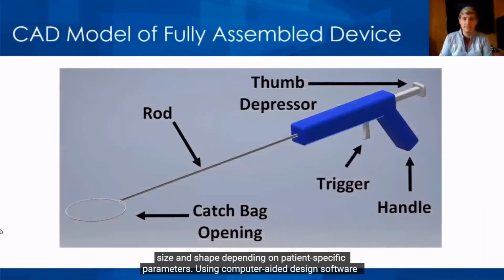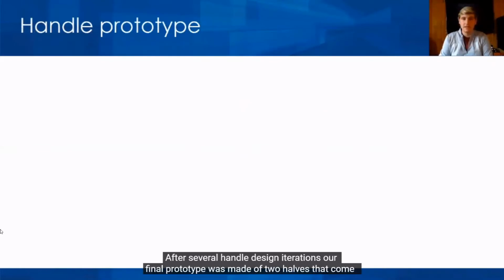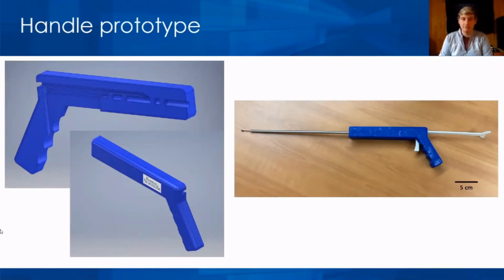Using computer-aided design software, the team created a mock-up of what a fully assembled version of our device might look like. After several handle design iterations, our final prototype was made of 2 halves that come together around a trigger mechanism and a plunger mechanism. The trigger mechanism is responsible for changing the size and shape of the bag by pulling and pushing on one end of the wire loop. The plunger mechanism pushes and pulls on both ends of the loop, opening and closing the bag.